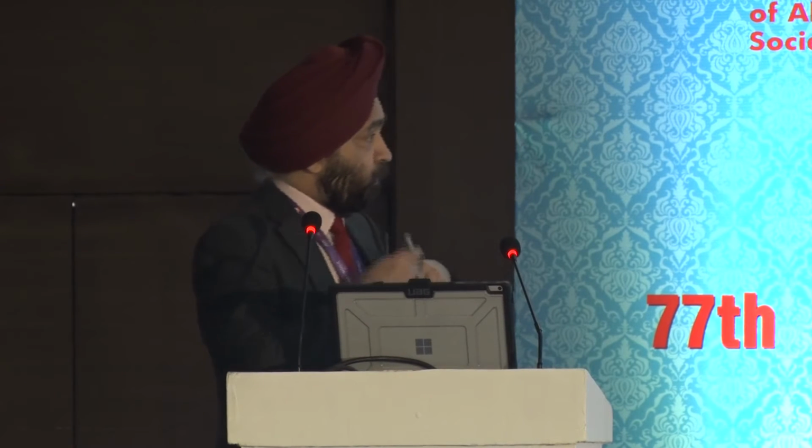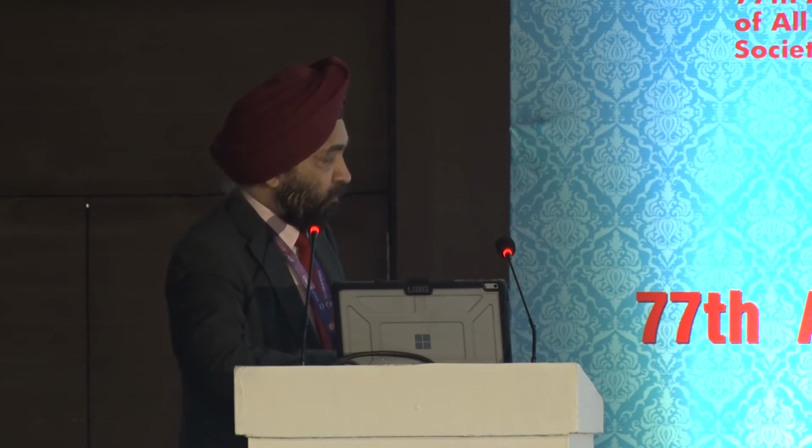Thank you. Sir, I have a question for you. If the cataract is totally mature, fully mature, or maybe hypermature, then do you get the same red reflex on retinal illumination with chandelier? No, you can't get a red glow with a total white cataract, but if it is totally white, it is much better than the other one. But then, if you don't have a corneal opacity and you have a mature cataract, then you don't actually need a chandelier. With corneal opacity, obviously, you have to have something coming back to you. So if the cataract is totally blocking out the light, you will not be able to get a red glow. Okay.